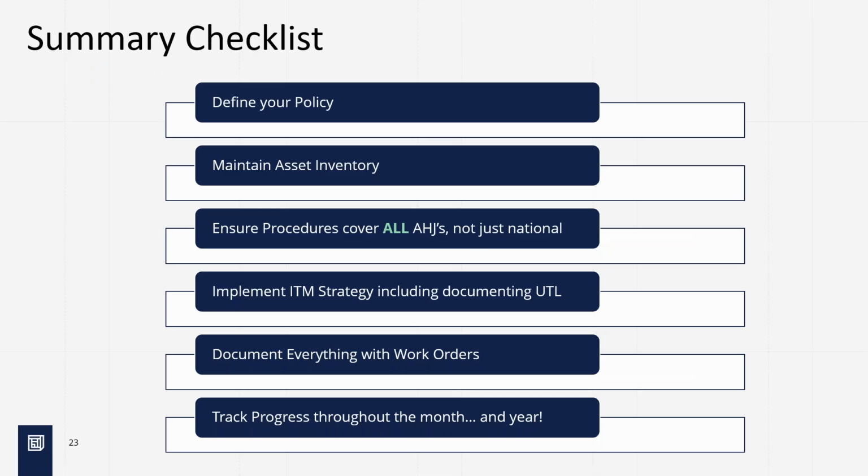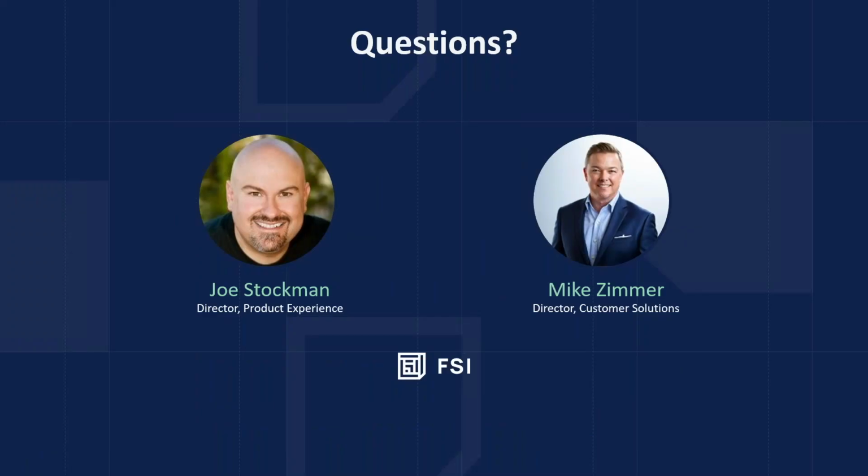So, way in the back, we got a question. If a new device shows up and it's not in your inventory, is there something that flags you that says, hey, we have this RFID tag that we don't recognize floating around, you might want to go find that and see what that is? We're not an RTLS system, but that would be a function of the RTLS system, but we could definitely consume that information and create the work order to say, go see what this is and enter it into your inventory. So that's a great call out of the use of an RTLS system.